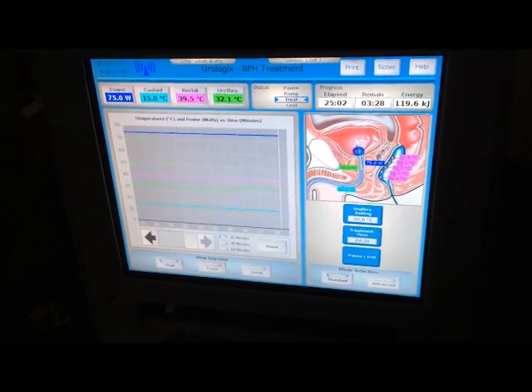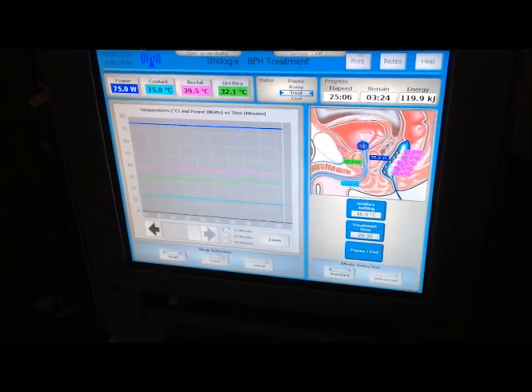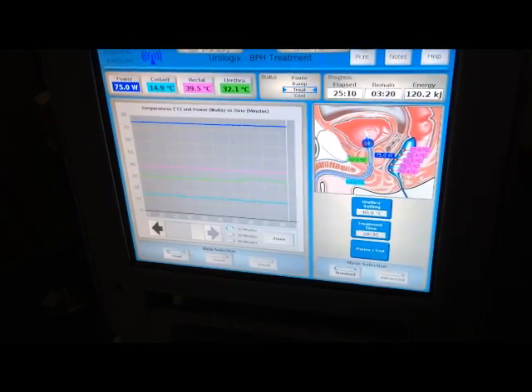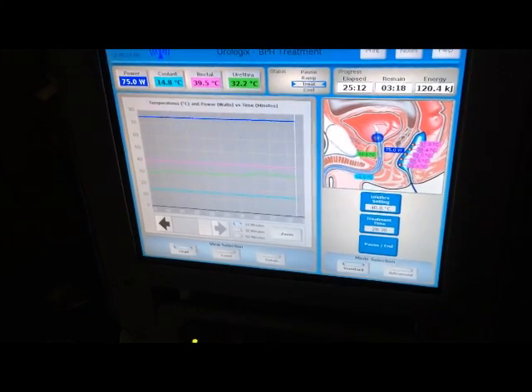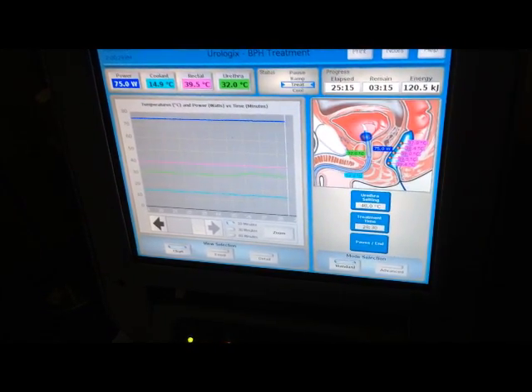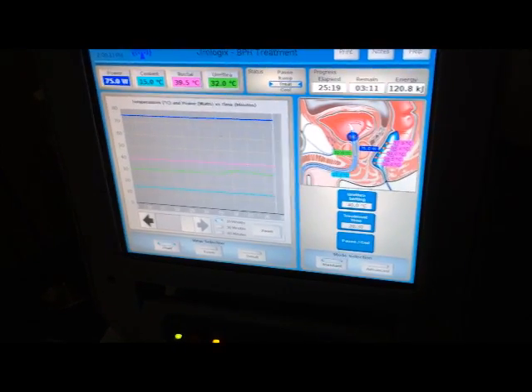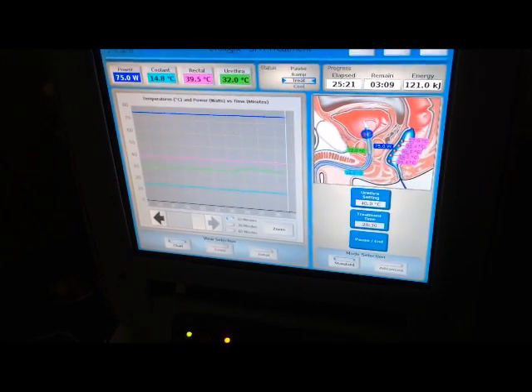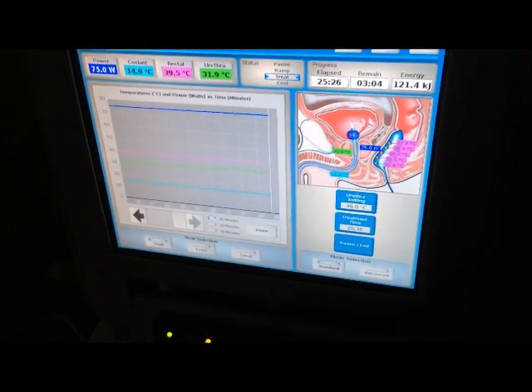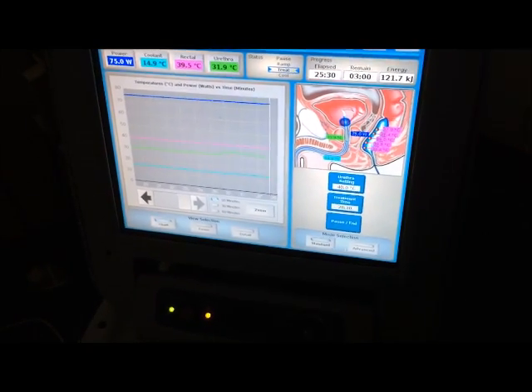We finish the treatment, deflate the balloon from the urethral treatment catheter, deflate the rectal balloon, and remove and dispose of all disposables. The temperature sensor and rectal temperature sensor are reusable; the rest of the unit is disposable, including the rectal balloon. Then we replace with a Foley catheter.